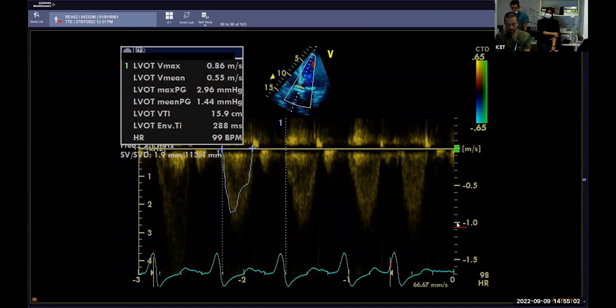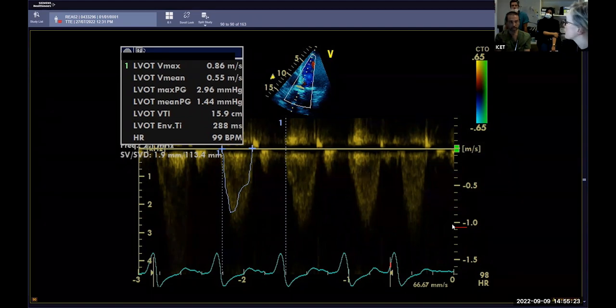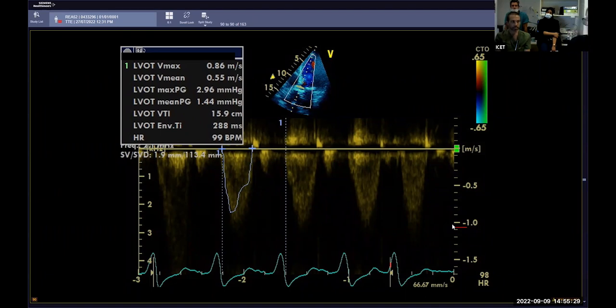Right. So aortic valve area, which we can attempt to calculate, velocities, gradients, and we've run through those already. We've spoken about DVI. Then the next thing is, what is the state of her left ventricle, and can we make that better to see whether we can get a more accurate representation of her flows across the valve? We need to get her left ventricular function better. The way we do that is by stressing it. Yep, so dobutamine stress echo.